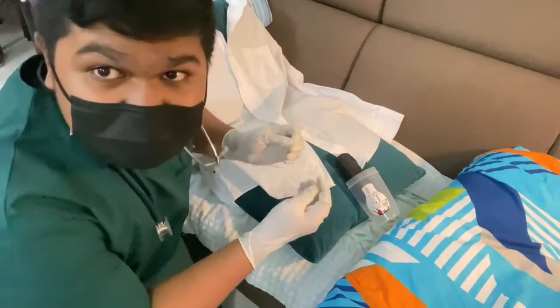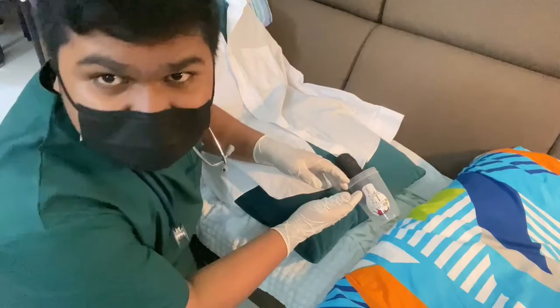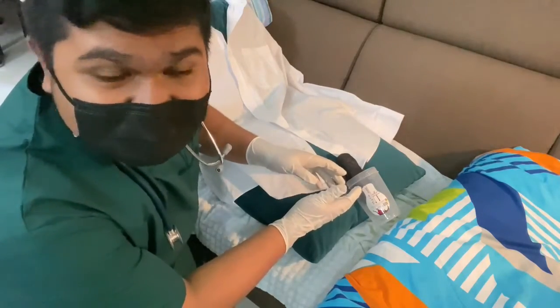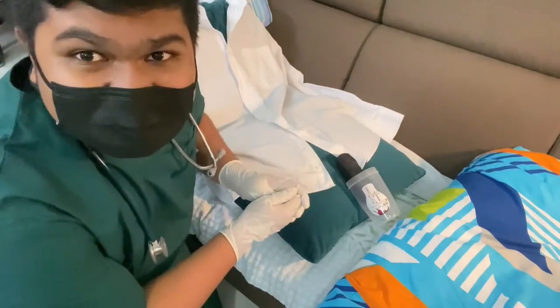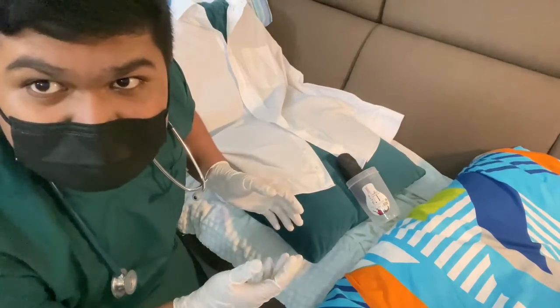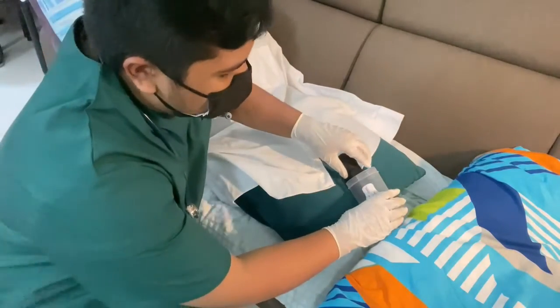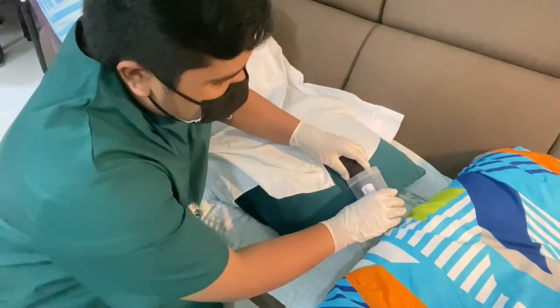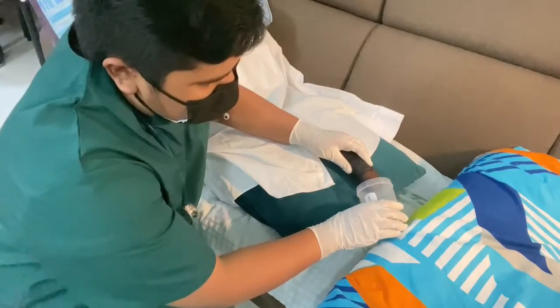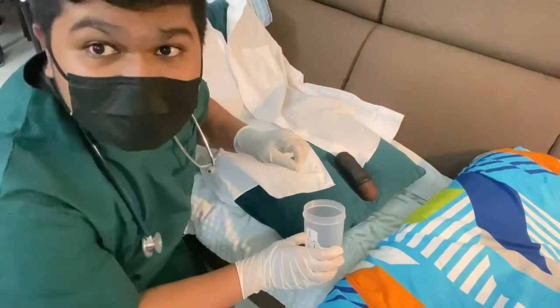Now, if it was a real world event, you would see the urinal being filled with urine. But in this circumstance, I wouldn't want to get my little sister's toys wet because she would get very angry. So then we remove the private part gently, not in a hurry, and place it back where it belongs.